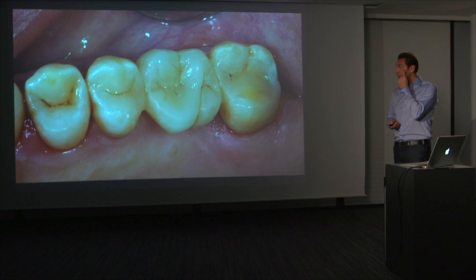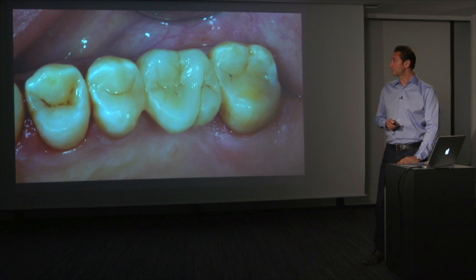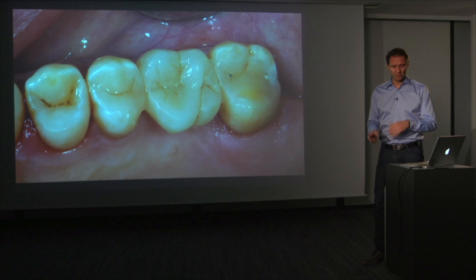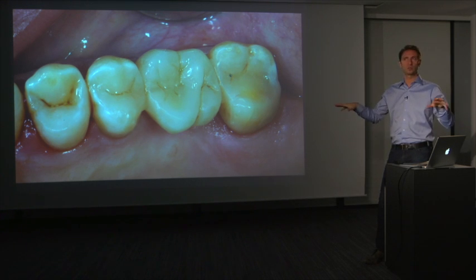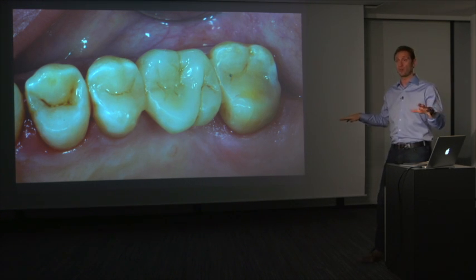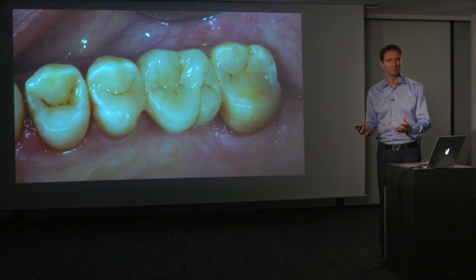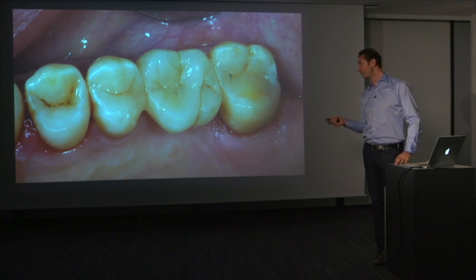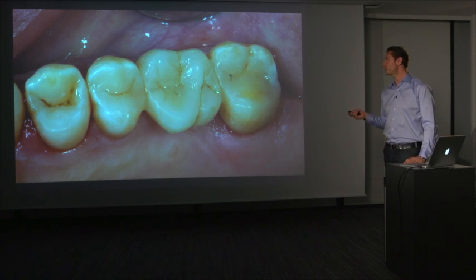So this is really offering a very elegant option for the patient, and it really extends the possibilities and creates, I think, a much more predictable outcome, because the problem many times with those restorations that were inlay supported was fracture through and through the pontic, so through the composite. If it's fiber reinforced with Everstick, and if you have a good core in Everx Posterior, there is hardly any chance that you will be able to fracture this easily.